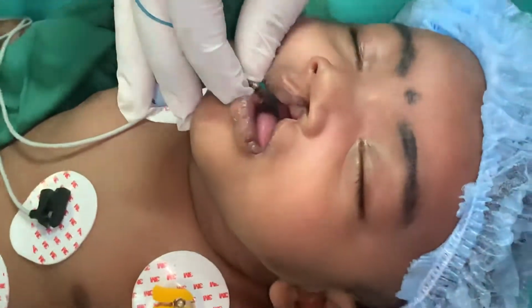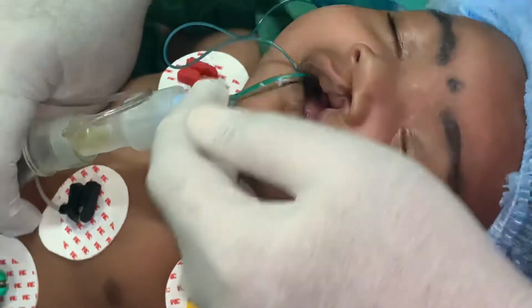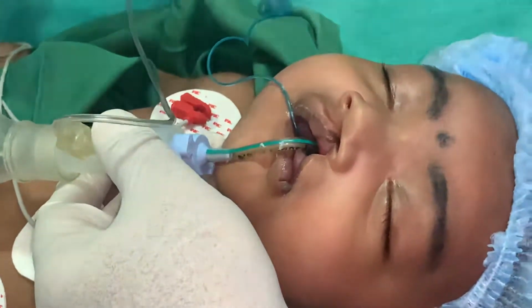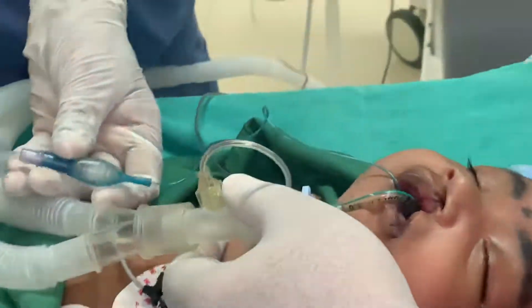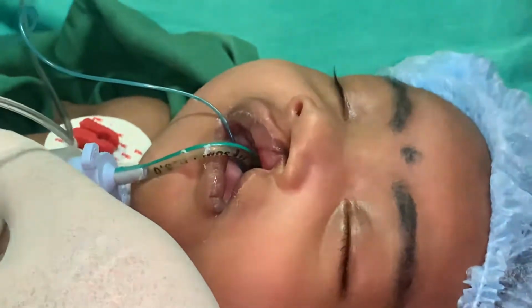So this is a RAE tube and it's a cuffed RAE tube. What's the size, Dr. Nishal? 3.5 or? This is 3. So we're using size number 3 for this patient. I'm supporting.